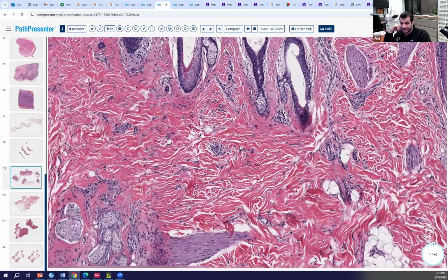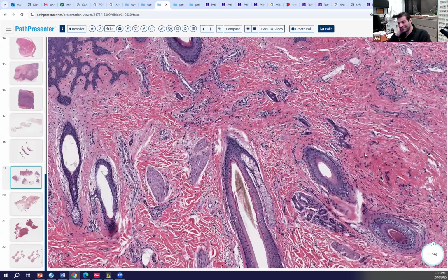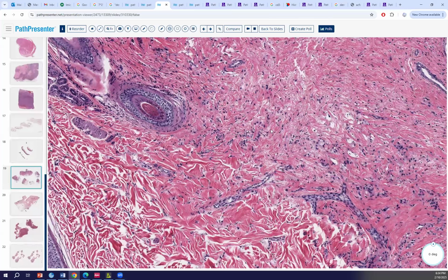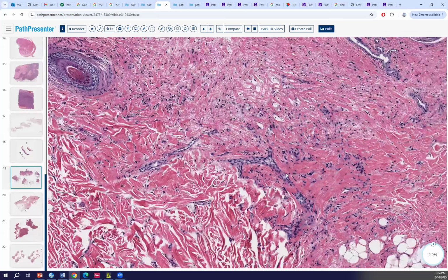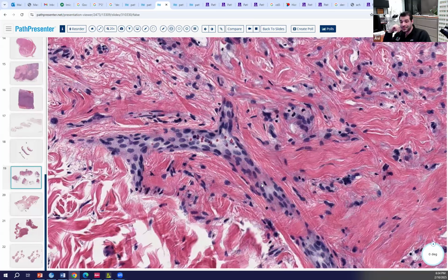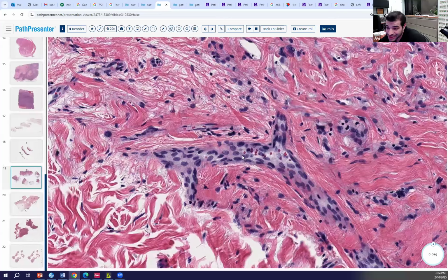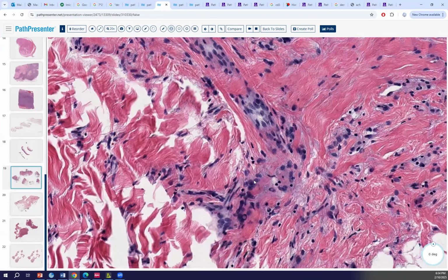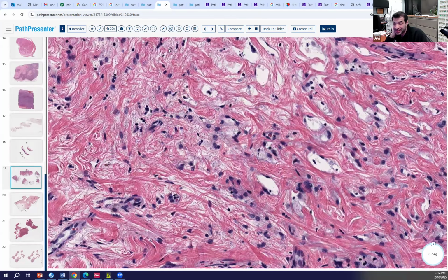Is this a meningeal... Very good. It's a rudimentary meningocele. Excellent. Good job. What were those little, really tiny red dots in that one you were showing? Yeah, these actually do look like blood cells in this case. But they're supposed to be pseudovascular. There might be background procedural hemorrhage.